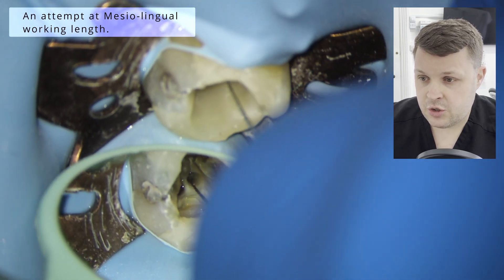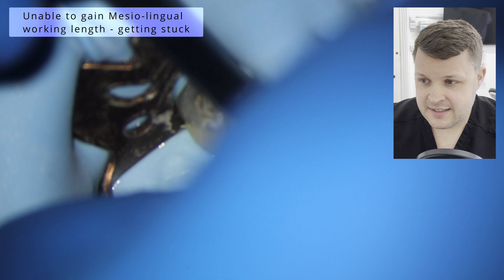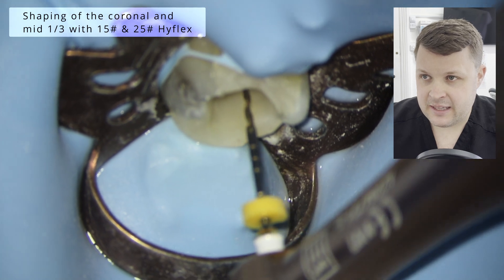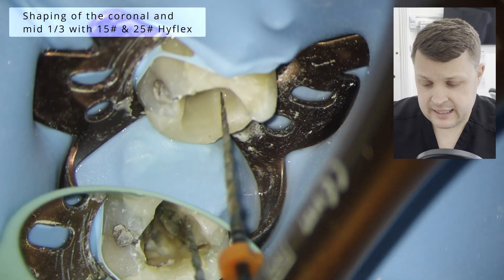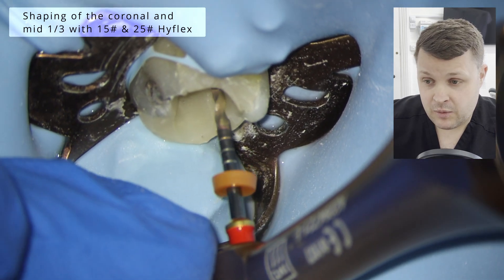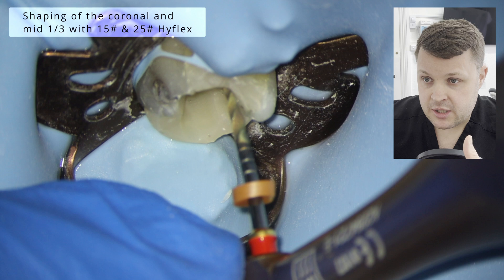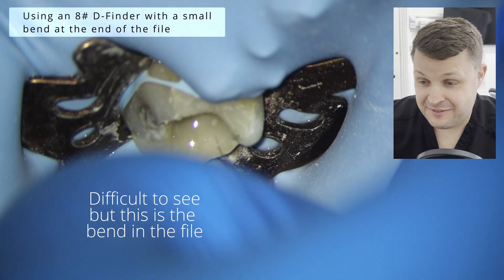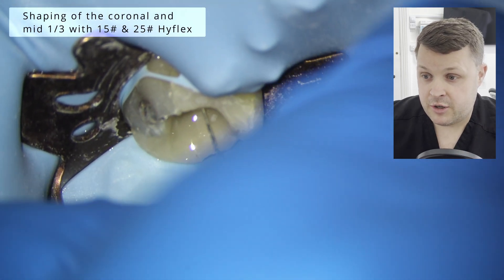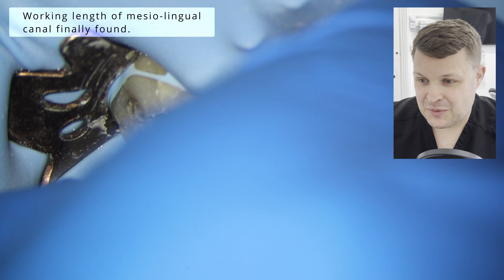Now we're going to attempt to find the working length of the mesiolingual. I've put a tiny little bend at the end, and I just can't quite get to the end here — the apex locator isn't giving me a nice zero reading. So what I'm going to do: if you can't get all the way to the end of a root canal, check to see how far you've got, and then just shape the canal space minus one millimeter for as far as we get. Usually the reason why the file can't get to length is because it's gripping further up. Then you make a nice little bend at the end, and finally we get to the working length.